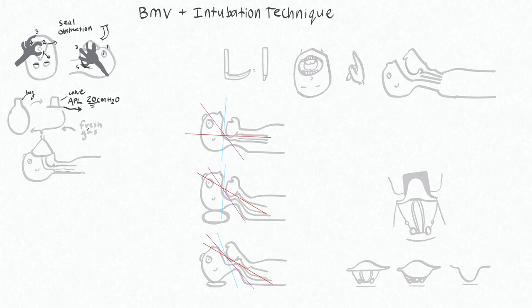We have a fresh gas flow inlet of this circuit and usually we'll set this to something like 15 liters per minute which is the max of 100% O2. So we have a steady stream of oxygen re-entering this breathing circuit in case we lose our seal and we're losing air to somewhere else. We want to be giving someone an FiO2 of 1 which is 100% oxygen.